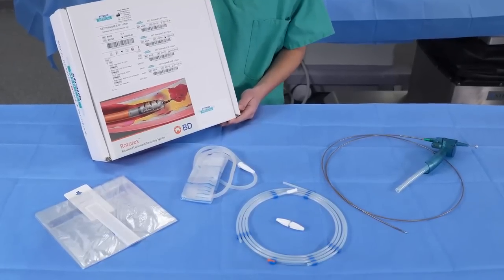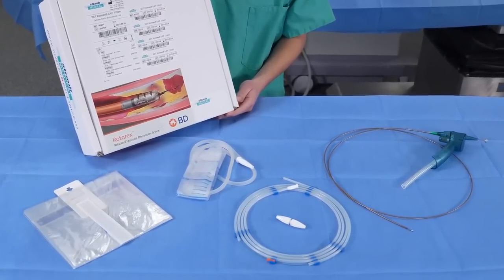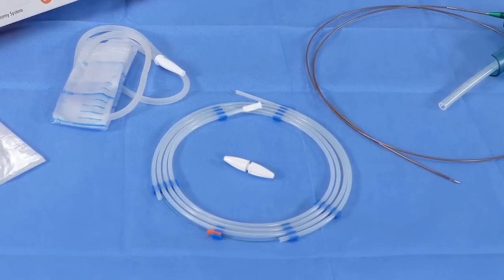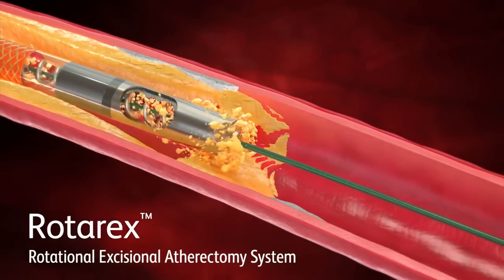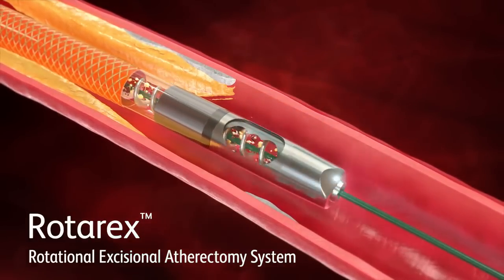In a healthcare environment where costs matter, all accessories are in each catheter set at no additional charge. This even includes the Rotarex hydrophilically coated nitinol guide wire. The BD Rotarex Rotational Excisional Atherectomy System: Modify, Excise, Aspirate.